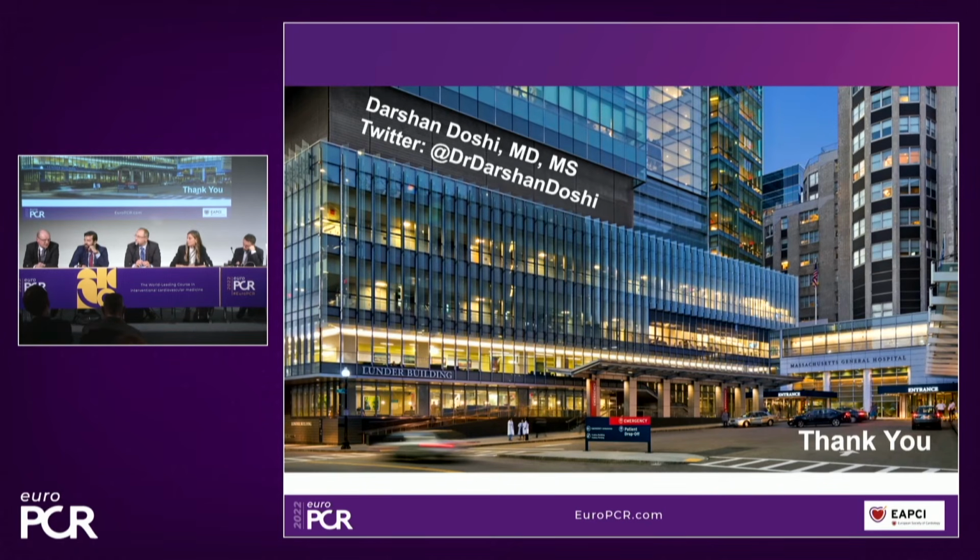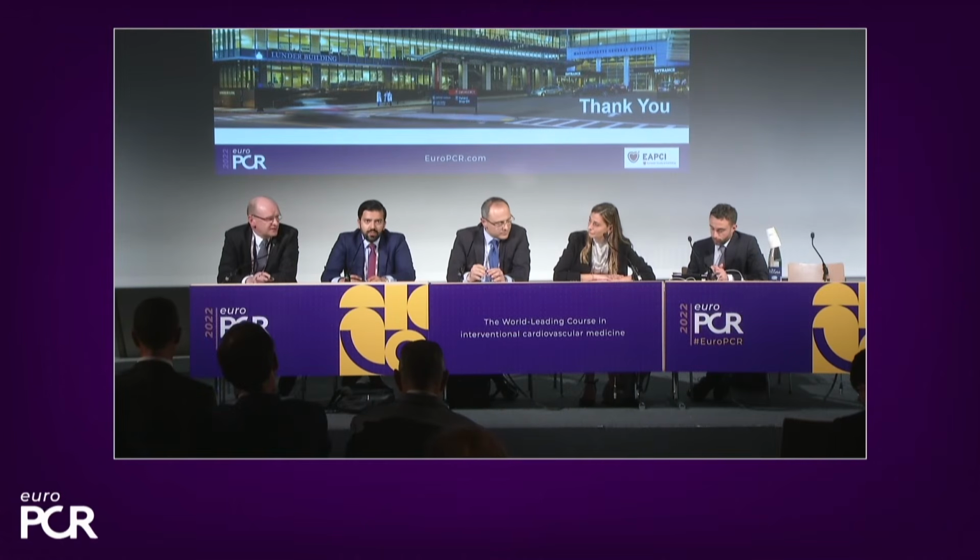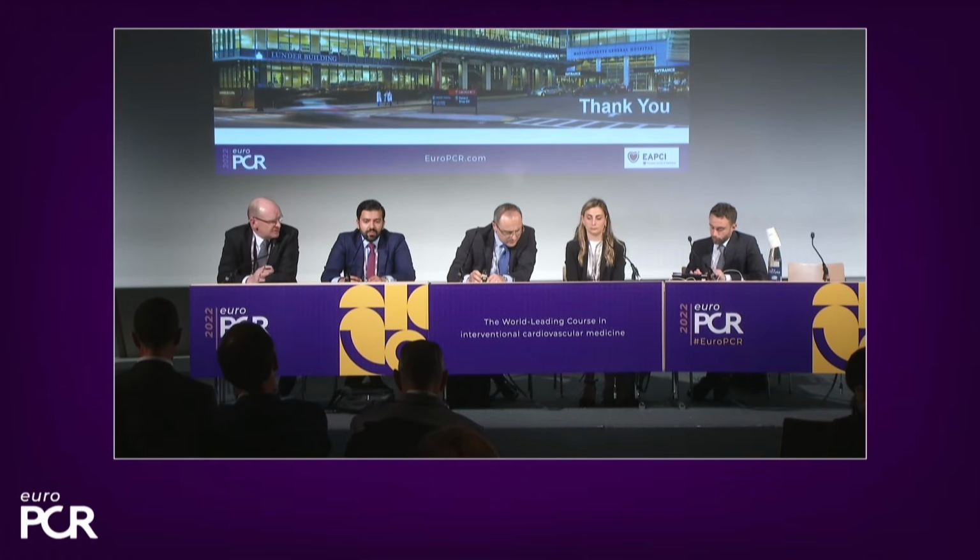And the size matrix, of course, and the flexibility of the size matrix. Even if you start off with a 3.5, you can take it up to way beyond 5. Yeah. And the opacity is also helpful, particularly in heavily calcified vessels. You can really see where the stent is, and you need to see where the stent is because you're going to need to be interacting with the left main ostium. So those aspects of that stent are also very important, I think, for the left main.